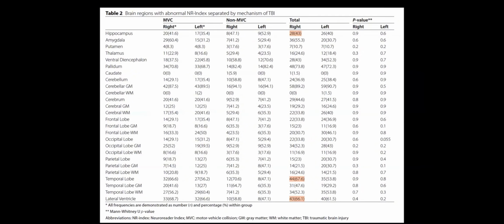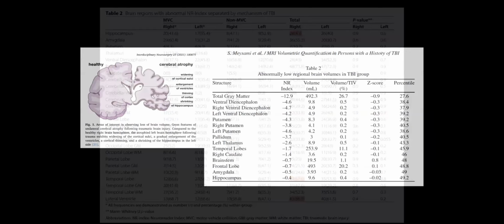We found that the areas that were abnormal included the hippocampus, the ventral diencephalon, and the lobar structures, the temporal lobes in particular. Two-thirds of individuals with TBI had temporal lobe abnormalities, for example. So we did find that those were frequently abnormal areas. Lateral ventricle abnormalities, or ventricular enlargement, were also very common after traumatic brain injury. So that was another common observation.